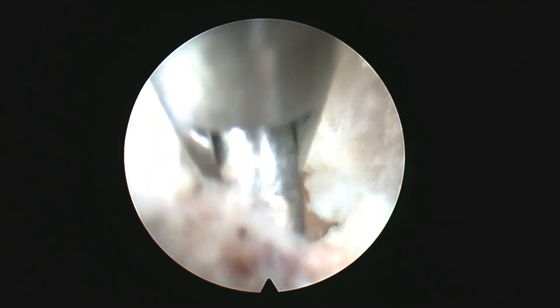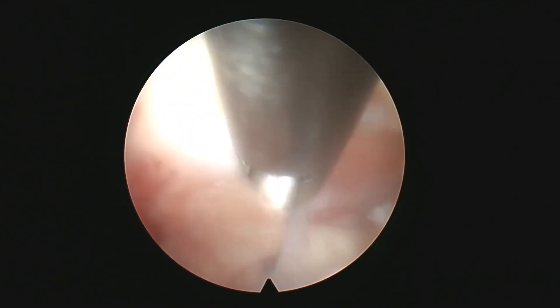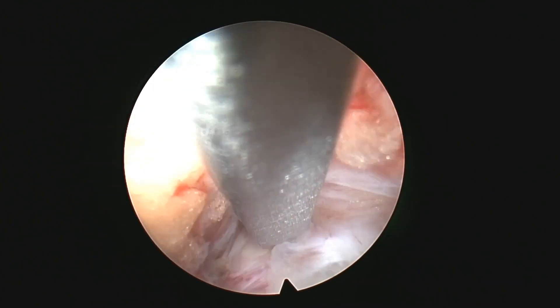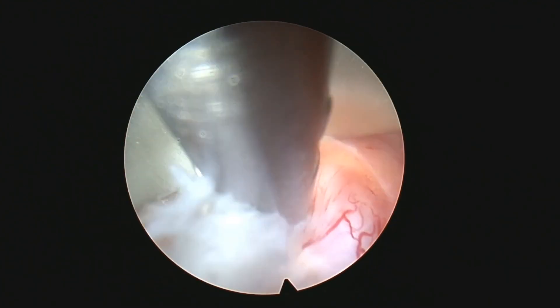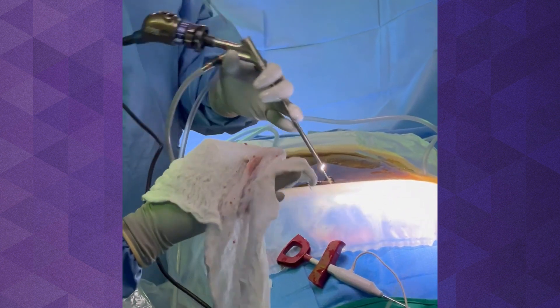We're using a scissor-type device to open the ligamentum flavum, and that will get us into the epidural space. At that stage, you can see the dura there. That's the nerve root, and we're going to dock on that disc space and start working on pulling the disc out. And here, you're going to see how that disc fragment is coming out of the patient's back.